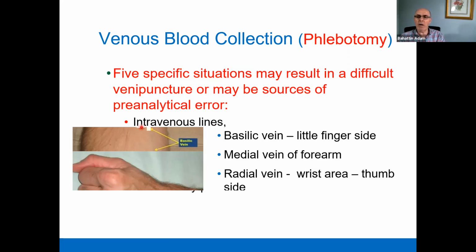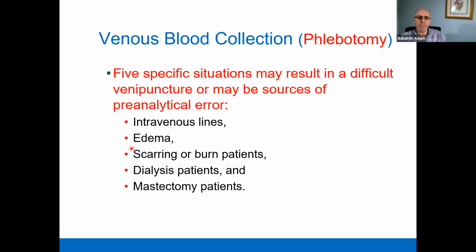Or if the patient has edema, it will be really hard to find the vein and withdraw blood.